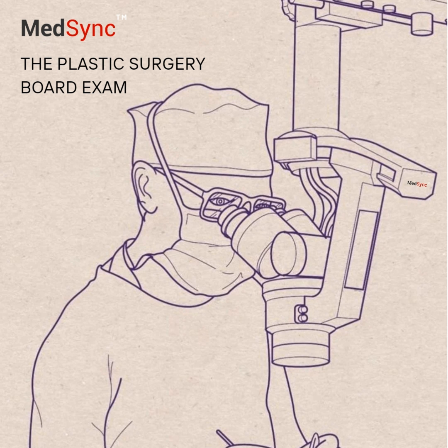Okay, let's talk specific surgical scenarios relevant for boards, extremities and orthopedic injuries. Yeah, NPWT is really useful here. Often first line for stable, clean extremity wounds before you get to definitive reconstruction. How does it help? Allows for serial debridements if needed, definitely helps reduce edema, improves perfusion, keeps exposed bone moist, which is important. It's compatible with orthopedic hardware. Good for post-fasciotomy management, too.